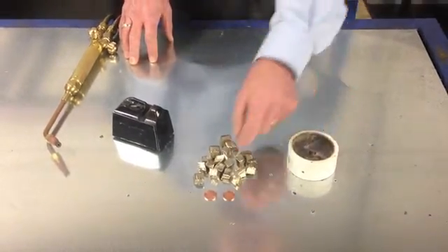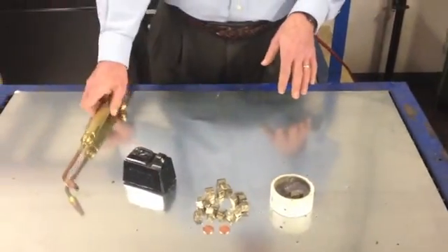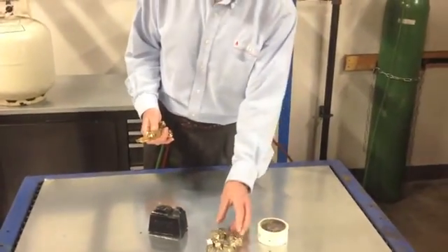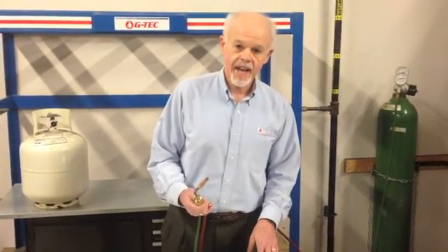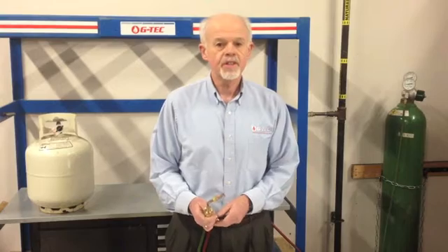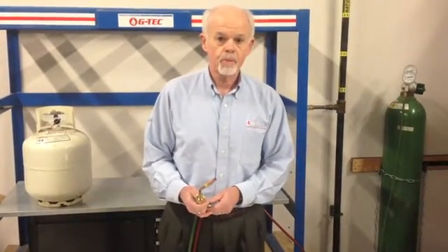So we're going to take our crucible here and take one of these nuggets and put it in, and I'm going to light up this torch, and I want to show you how quickly this can melt. Again, the point here is I want to show you that high pressure natural gas is an excellent fuel for casting. Now I'm going to use my casting torch with a natural gas pressure of 10 psi and an oxygen pressure of 25 psi. And yes, you'll continue to use oxygen just the same way as you do with either your acetylene or your propane today.